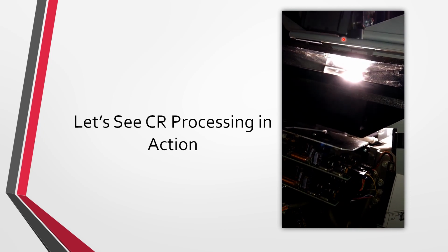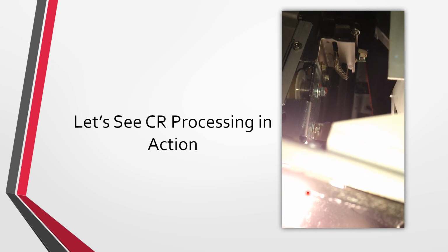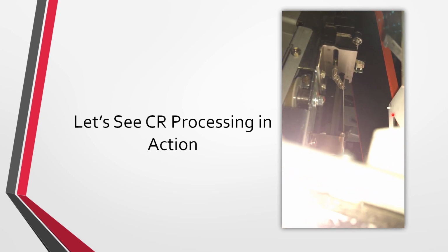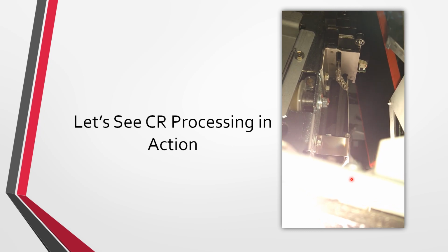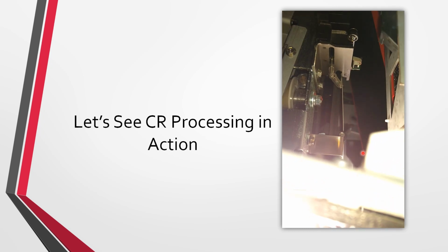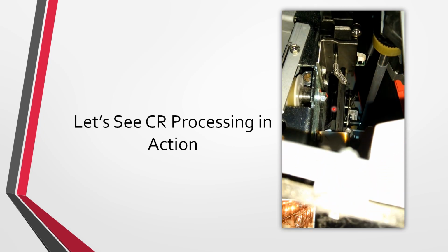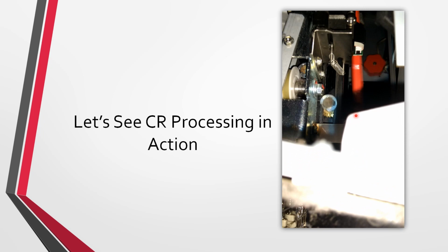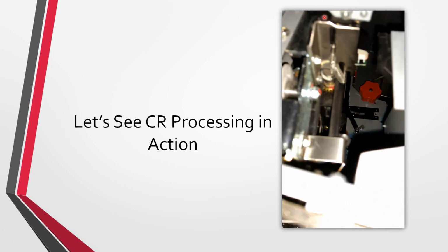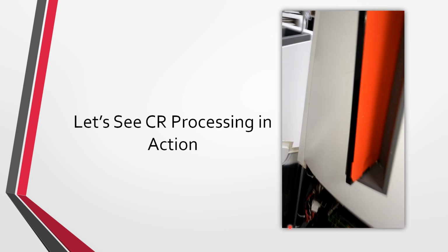At this step, it's the erasure process, the very white light that we can see clearly here. It's going to erase the image plate. The suction cups, once it starts moving, are going to take the IR, the PSP, the image plate, all those things, and put it back in the cassette, as we saw right there. The cassette's going to close. It's then going to be ejected, and it can be used again.